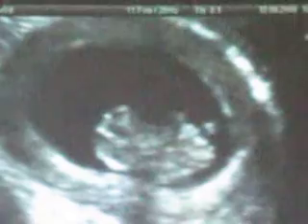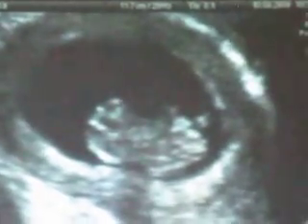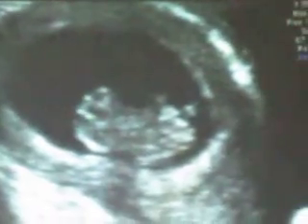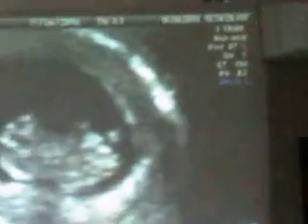Is she having regular cycles? Nearly regular cycles. Regular cycles. That's nice. So this is a baby which is actually sitting on the fence. You can choose to change the dates here, or you can choose to retain her date. We will wait for the 11-week scan and we will be able to see the fetus much better. So this is about 9 weeks 4 days, 10 weeks, so it's quite all right.